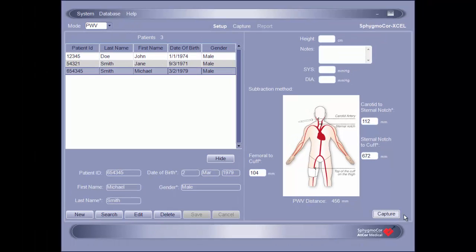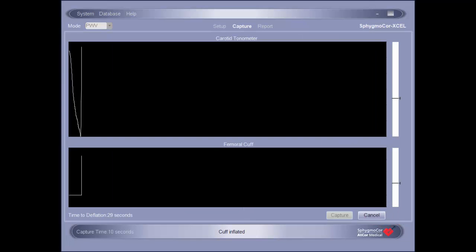The SphigmaCore XL software also includes fields for entering the patient's blood pressures, height, and a notes section for free text. However, it is optional to enter this information — only the distances are required to conduct a pulse wave velocity assessment. Once the desired information has been entered, click Capture to begin the assessment.